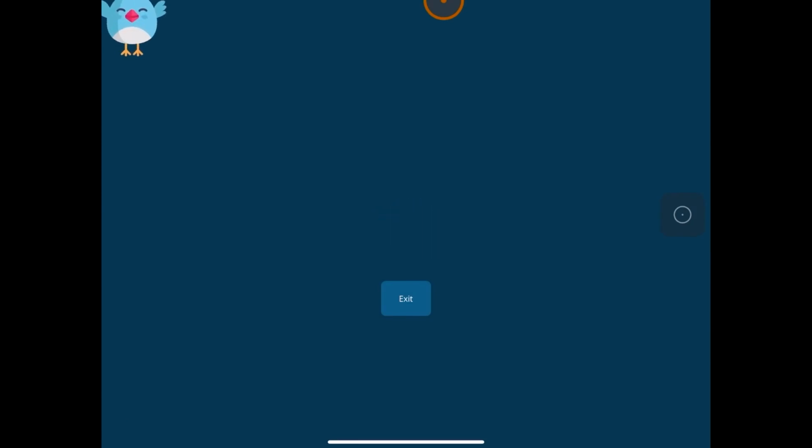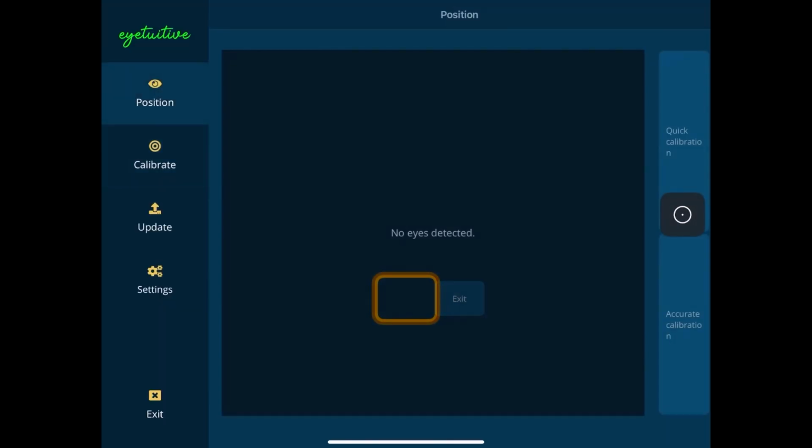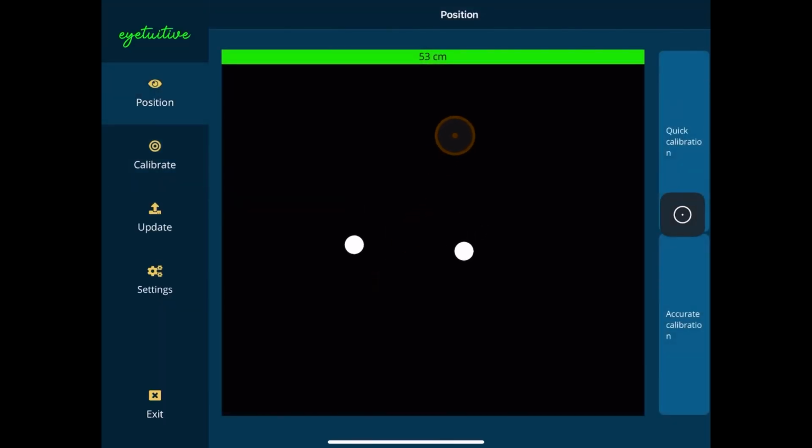So this is a quick calibration, a 5-point calibration. I'm showing you now with the animated bird. So you can see it's giving that sound effect there to attract attention. Now you can see on the green and oranges, it was okay. There's some 70s, 60s% calibration result.